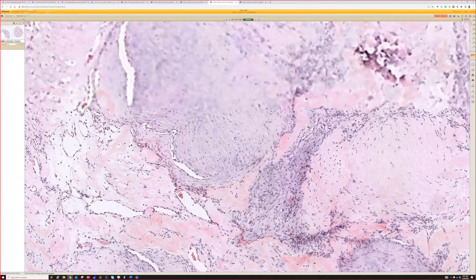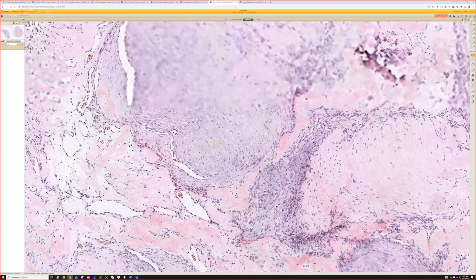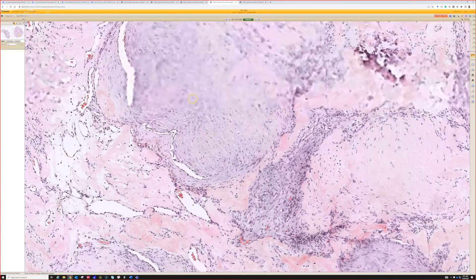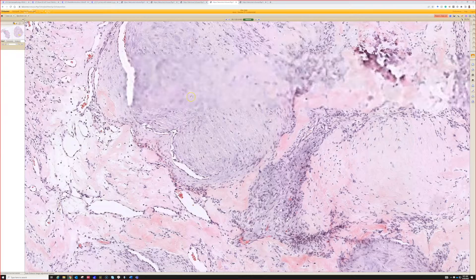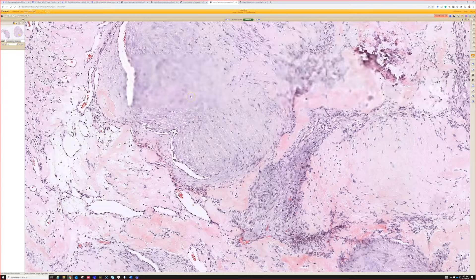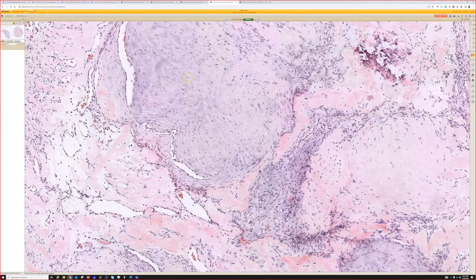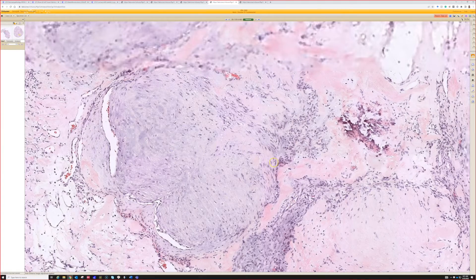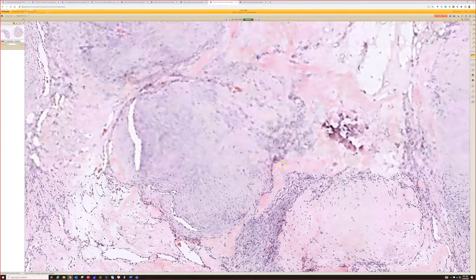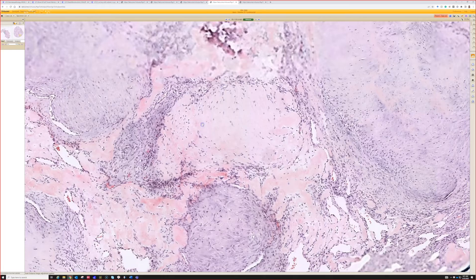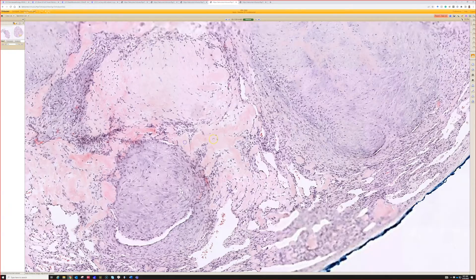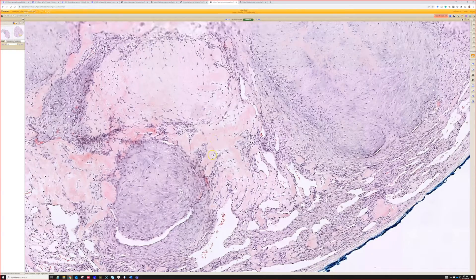You can see it here also, kind of bulging and growing into these crescent shaped vascular channels. So what did you think this was? Myofibroma. Yeah, very good, this is a myofibroma.